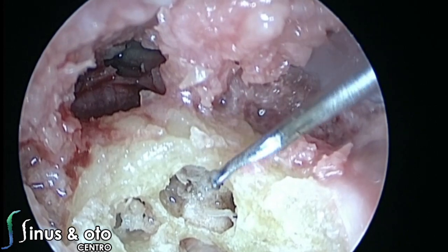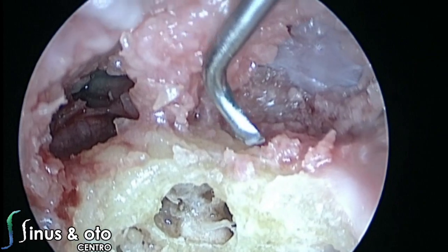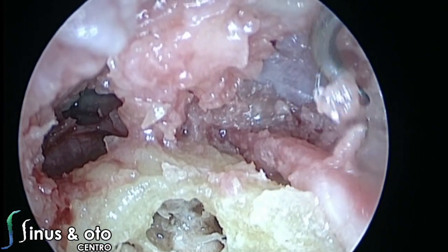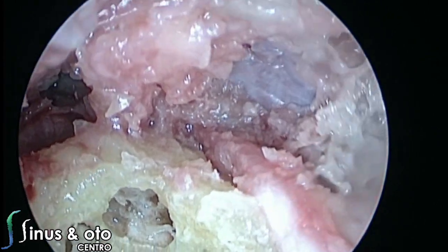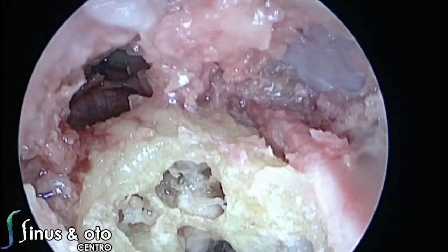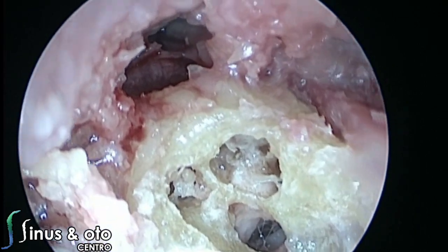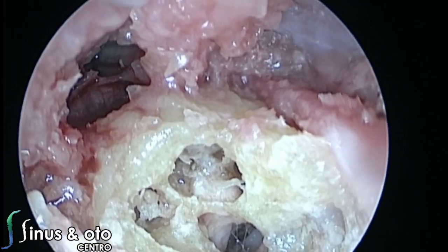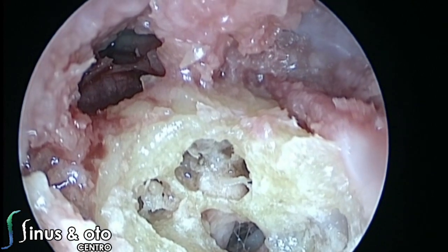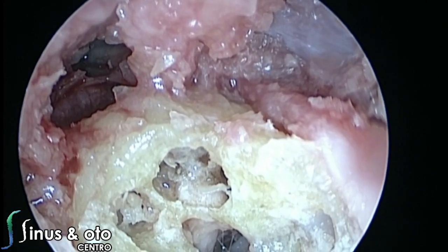So you have this most superior part of the cochlear nerve, facial nerve, and vestibular nerves over there. Facial nerve going to the geniculate ganglion. This is the tympanic segment of the facial nerve. The middle fossa dura is there. The tegmen is there on the right side. The hypotympanic cells are there. The jugular bulb is going to be over there also. We didn't expose the jugular bulb in this case, but it's a very important way to understand anatomy.